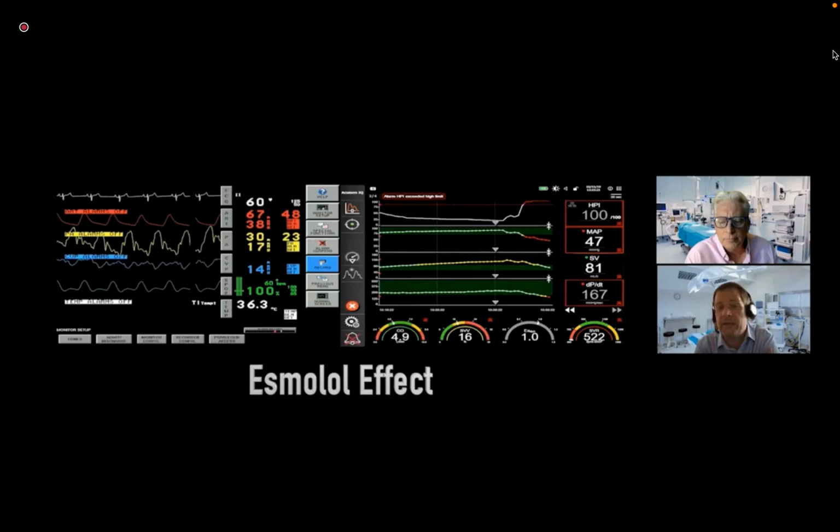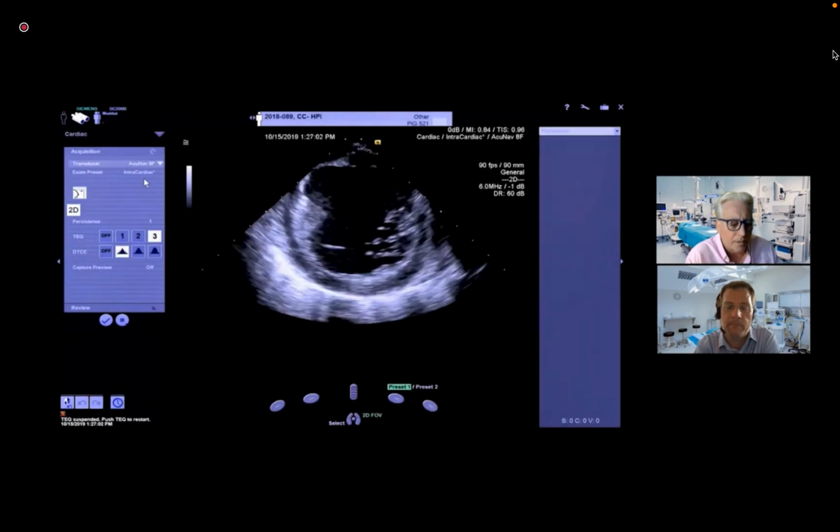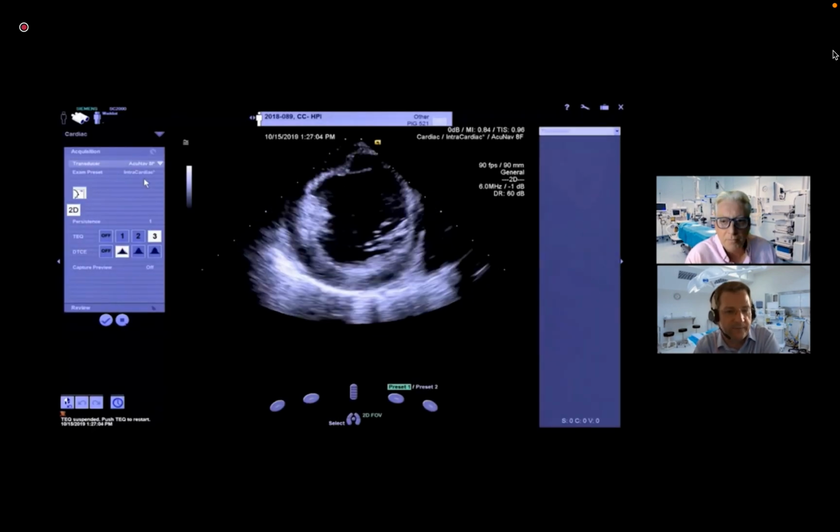Good. So yes, DP/DT has decreased from our starting values of around 230 or so down to 160. So a substantial relative reduction in contractility, and we've seen our stroke volume decrease by a very similar amount as well. So DP/DT seems to reflect, certainly in terms of the pharmacological intervention, a measurement of our left ventricular contractility. And the proof of the pudding.